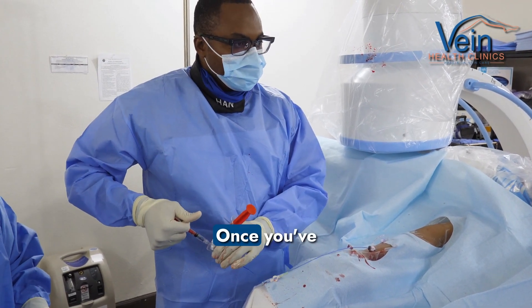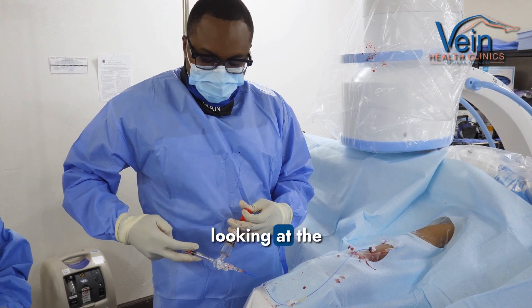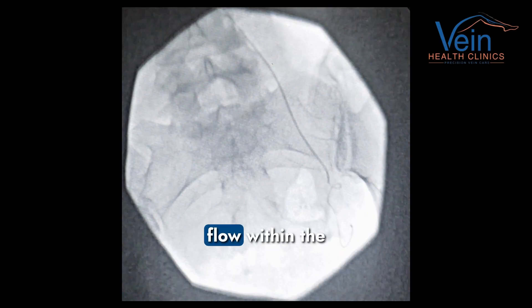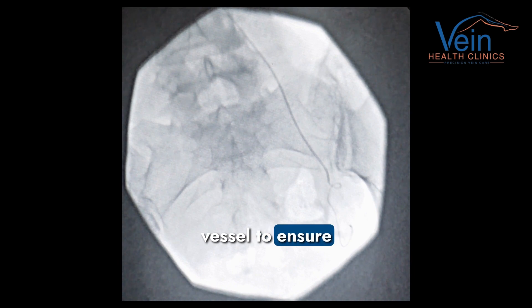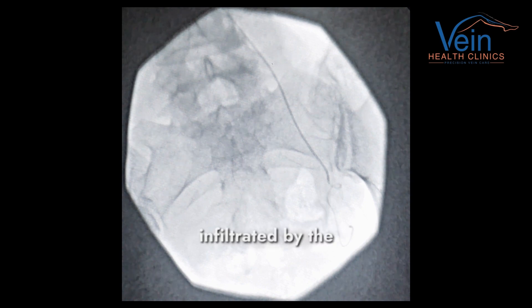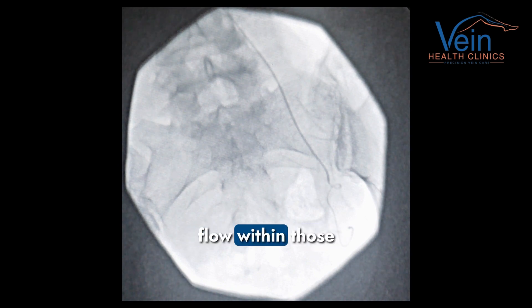Once you've injected the particles, you're basically looking at the screen the whole time to make sure there's continuous forward flow within the vessel to ensure that those particles only go into fibroids. Once you stop having forward flow, we stop injecting. We know at that point that the fibroids are completely infiltrated by the particles and there should be no more flow within those fibroids.